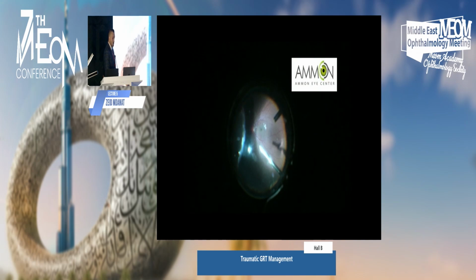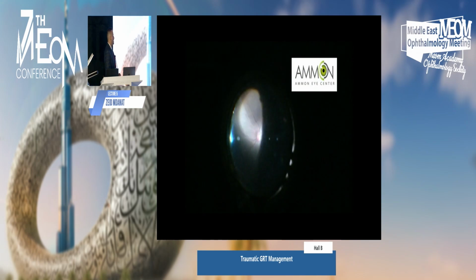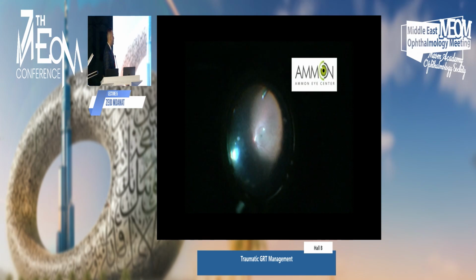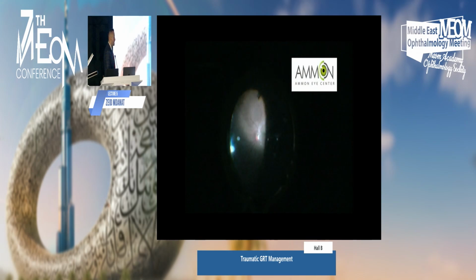I prefer to use PFCL to return the retina to its physiological or near physiological location. I've done it in different ways, but I think doing it with the PFCL is the best way to reduce the risk of retinal displacement and or rotation. So when I fill the vitreous cavity with PFCL, I make sure, now I'll show you with indentation, that the edges of the GRT are flat, and then I start my treatment.